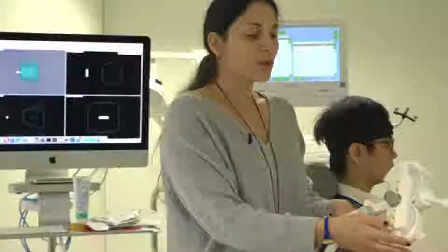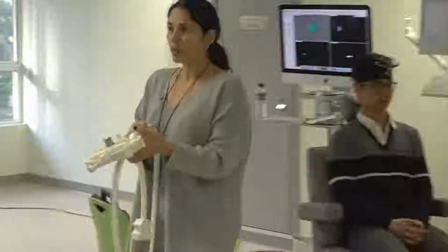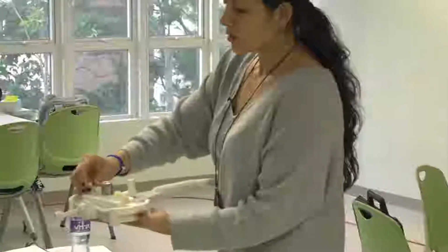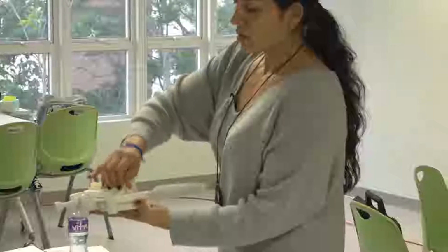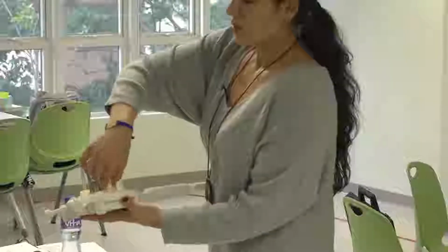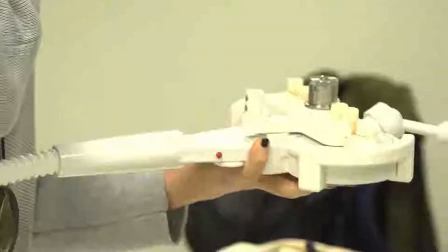So we put this thing yesterday here. This is not part of the coil. We put it yesterday, so you can remove it. I don't know if you're familiar with this. I don't have one of these in the lab where I am. I have never had one of these. But Joseph told me, and I believe him, that they are using it for the holder.